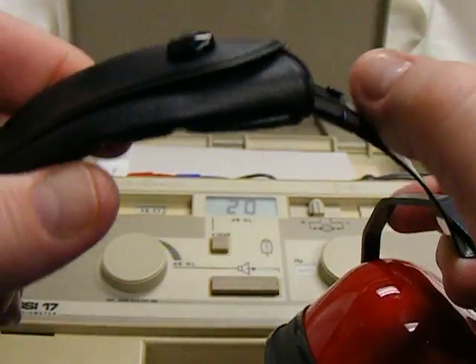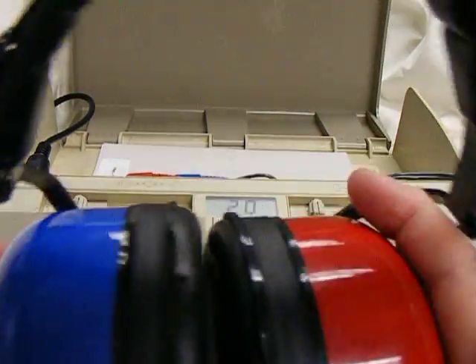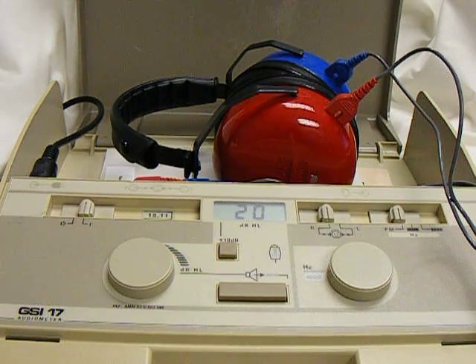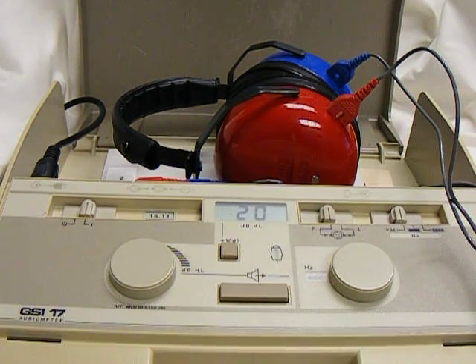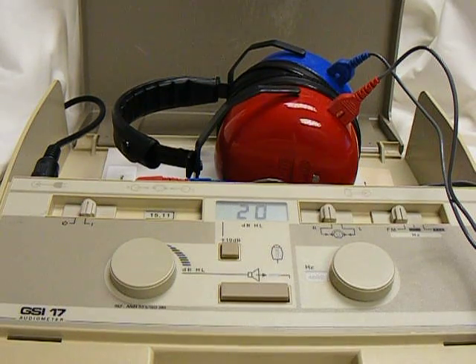You should have no problem making the headband fit snugly over the top of the student's head. If a student is wearing a hard plastic headband, a baseball cap, big earrings, or glasses, you will want them to take them off prior to fitting the earphones. They should be snug on the student's ears.